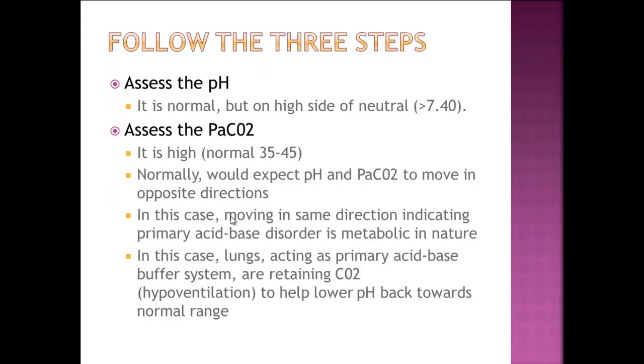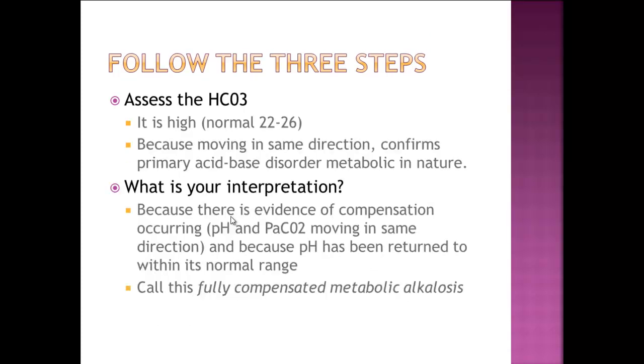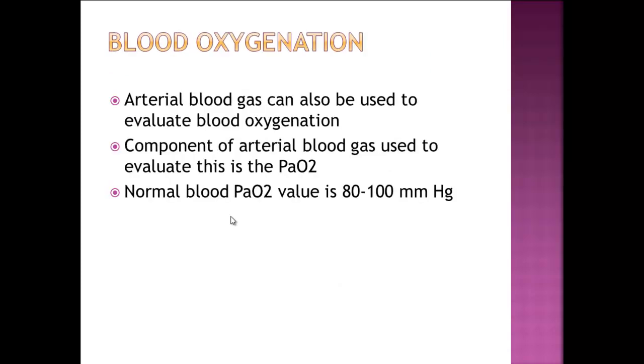Okay, and here we go again with the step-by-step discussion of how we arrived at the decision that that was a fully compensated metabolic alkalosis.